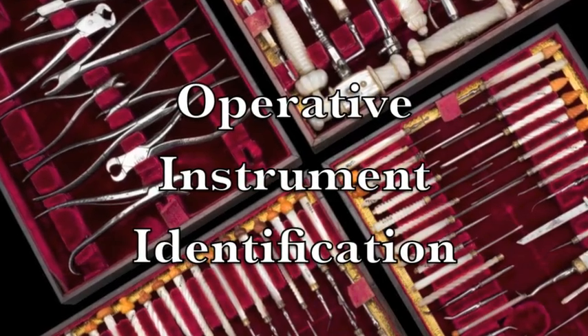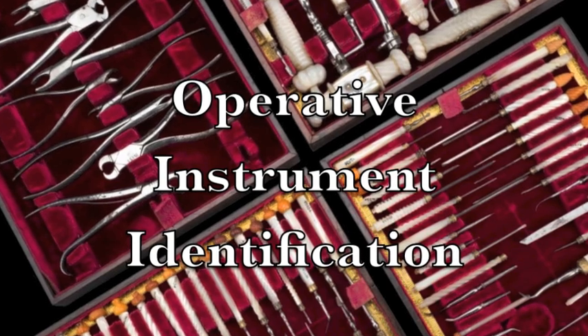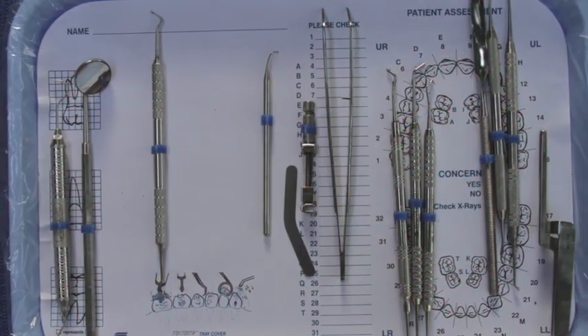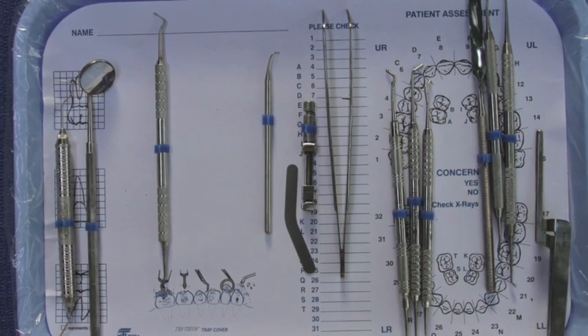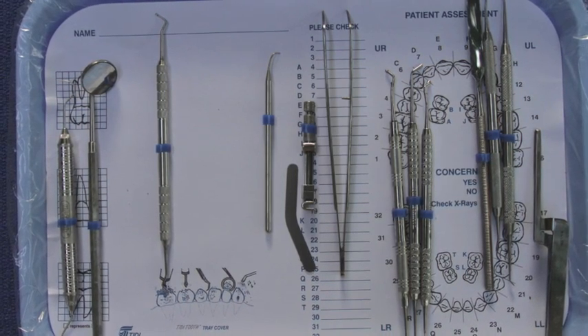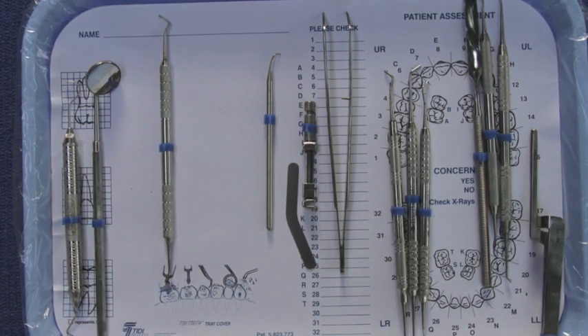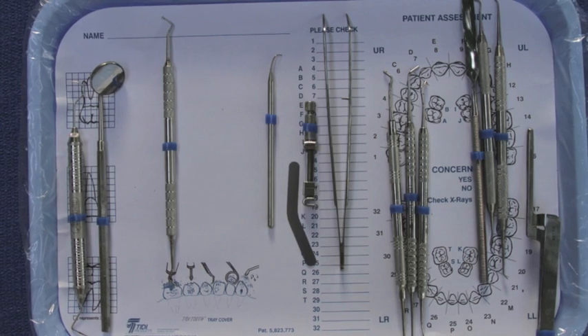In this video we're going to be showing you some of the more common operative instruments that you'll be exposed to while you serve with the University of Florida College of Dentistry. It's going to be important for you to be familiar with their names and their function, as the dentists that you're going to be working with are going to be asking you for these instruments and they're going to be using them as they provide care to their patients.